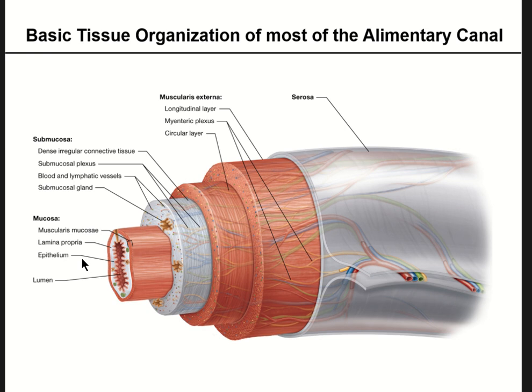What you'll find is that there are actually quite a few similarities between them. But this is really where you're going to find your lymph vessels and your MALT tissue and all that. And I really want you to keep your eye out for the submucosal layer in some of these slides, because the submucosa is a great way to identify the differences between some of these parts.